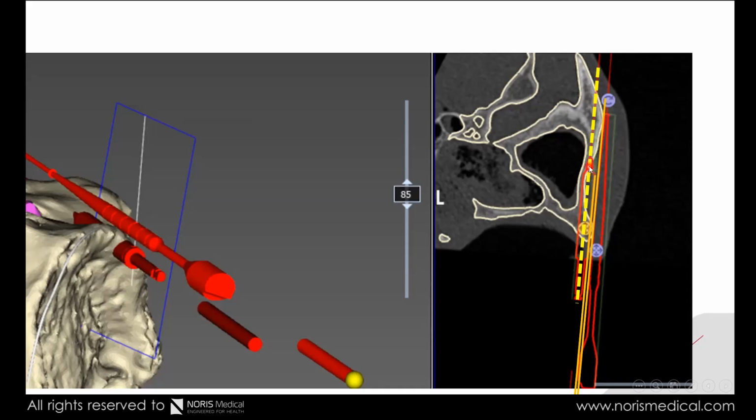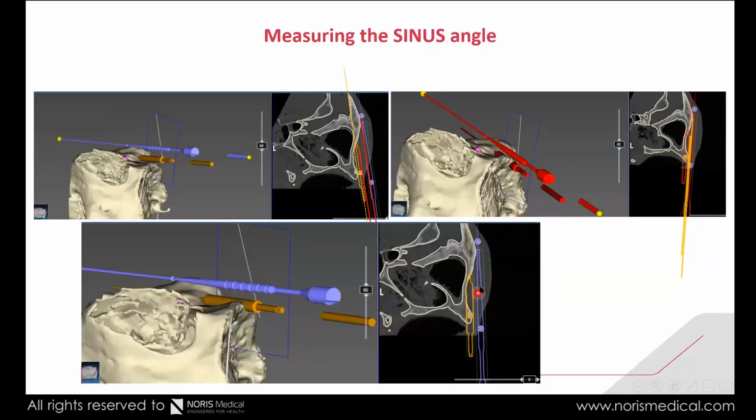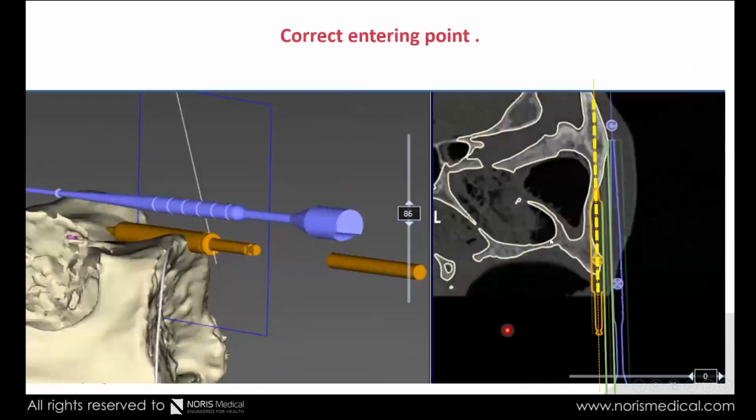In this case, as I said, we will just take the diamond tool away, and we will start at this point again. We'll make a drill here, and then this movement of the diamond tool would make us change the angle. We'll see it on the next slide. Okay, we've talked about these two. You see, we took the diamond further back, and now it's actually showing us the correct angle, and we have the distance that we wanted. You can see it here. We have the distance that we wanted, and we have the correct angle.